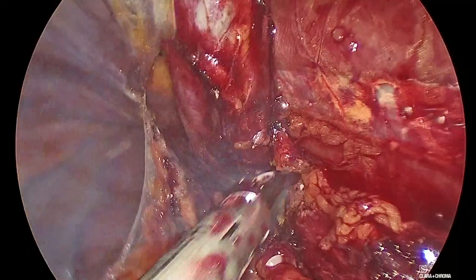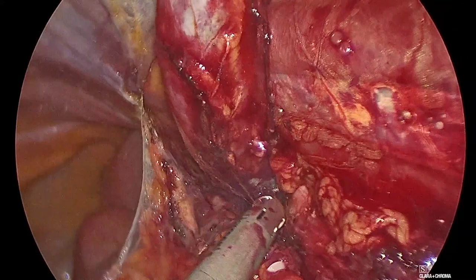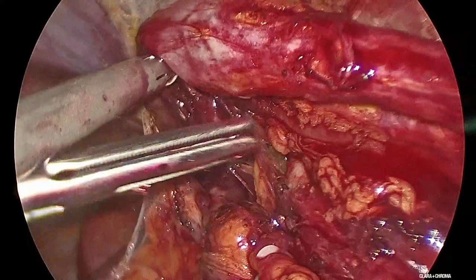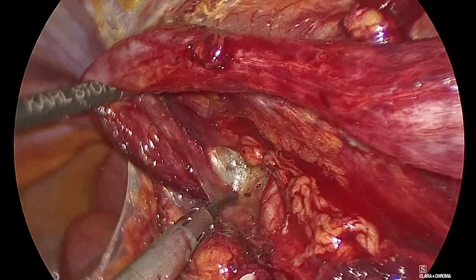See, the iliac artery is here. I think that's a huge mistake, because then is where we see the recurrences and then we take care, and then it's difficult to go in there and resect the distal portion of the ureter of a patient that has been already operated. So I think it has to be done in a good way and safely.